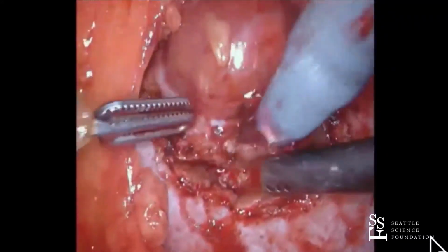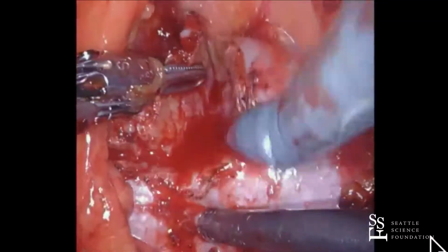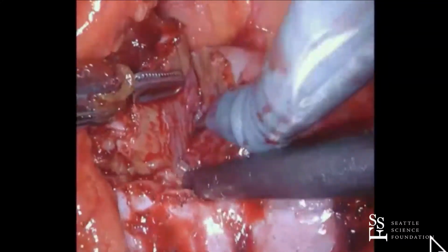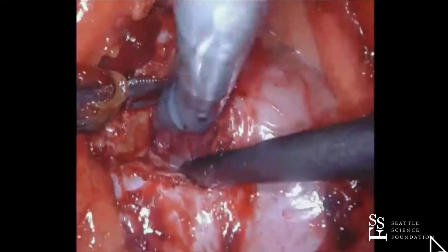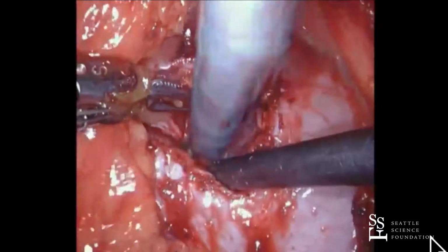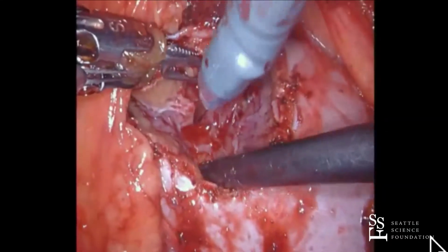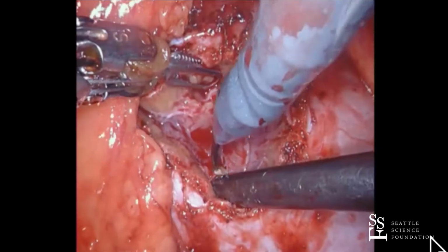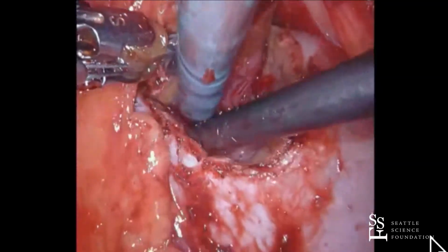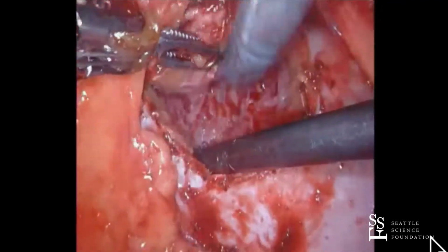I don't give anything. Jim gave Lasix on this case. Yeah, I don't ever. There's been some good data recently that basically debunked it. If the patient is relatively dehydrated, which a lot of these patients are when they come in for surgery because they've been NPO after midnight, I don't want to give Lasix to a dehydrated patient. So my routine is just to ask anesthesia to give them a ton of fluids. To me, that's just as good.